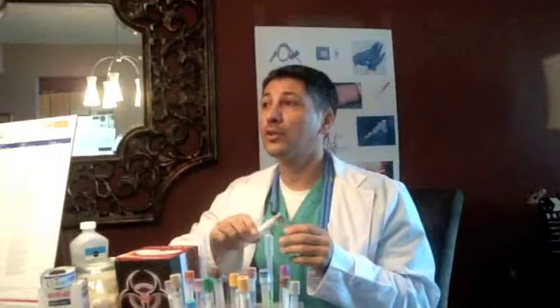First, blood culture, the yellow tubes; coagulation tubes, light blue; serum tube with or without clot activator, the red; heparin tube, the green; EDTA is the lavender; and glycolytic inhibitor is the gray. Each tube containing an additive should be gently inverted 5 to 8 times after being removed from the holder. Do not shake or mix vigorously.